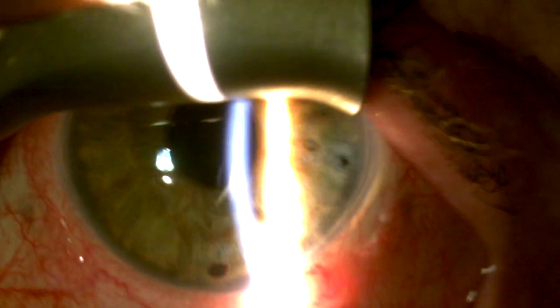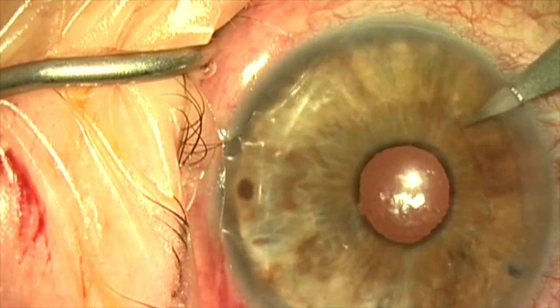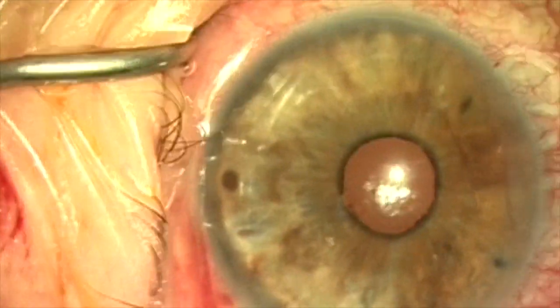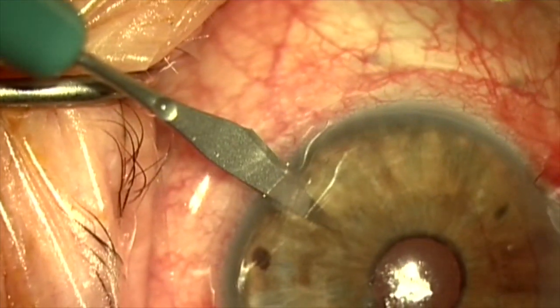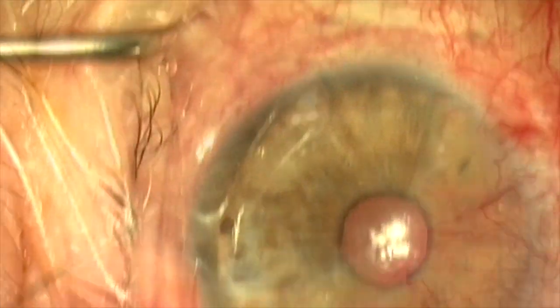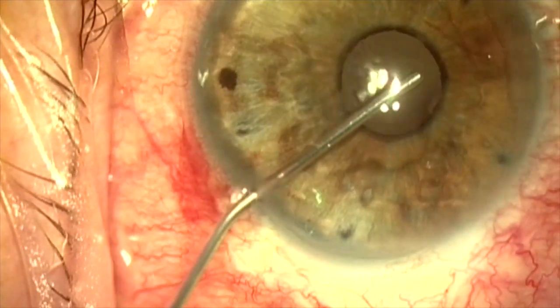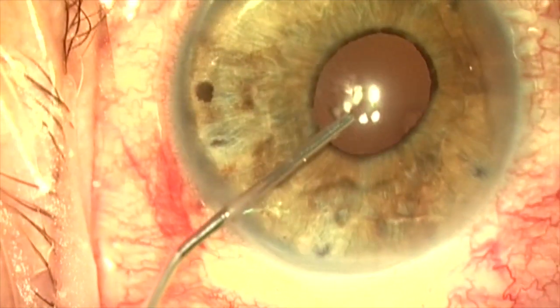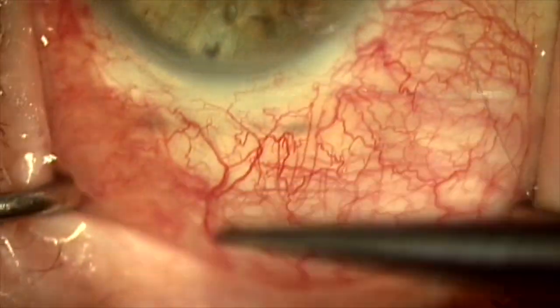A decision was made to bring her to the operating room and do a pupil-sparing cerclage with a 33-gauge needle. I made four paracenteses and injected viscoelastic to stabilize the anterior chamber. The plan is to perform a pupil-sparing iris cerclage.